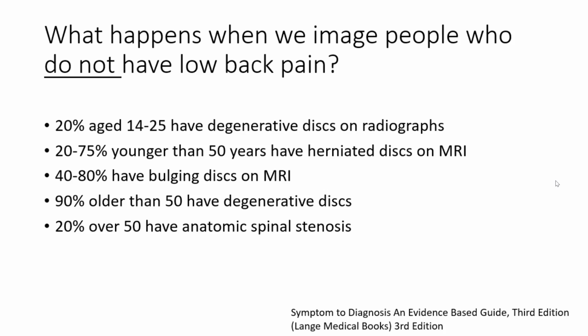It leads to inappropriate aggressive interventions such as injections and surgery and excessive patient worry, and can really confound spinal treatment. So it's important we appreciate that as we spend the rest of the lecture today discussing lumbar disc pathology. While we can really see a lot of lumbar anatomy and appreciate some of the subtleties between disc bulges and herniations and high intensity zones, it's always important to put it in context appropriately.